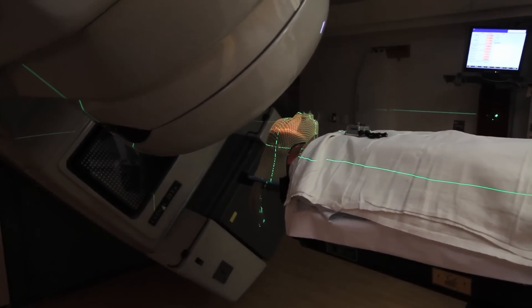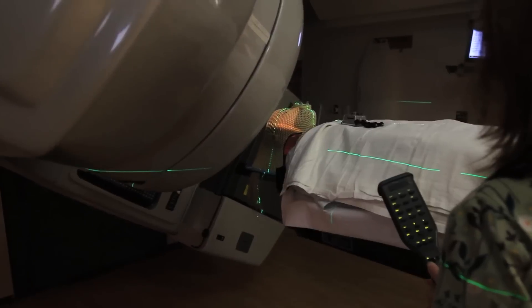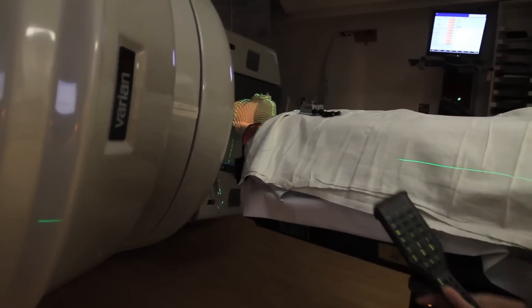We're going to stand right outside the door. We can hear you and see you at all times. You'll be finished in about five minutes.